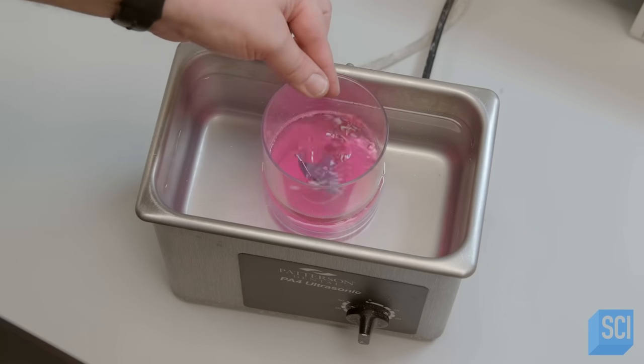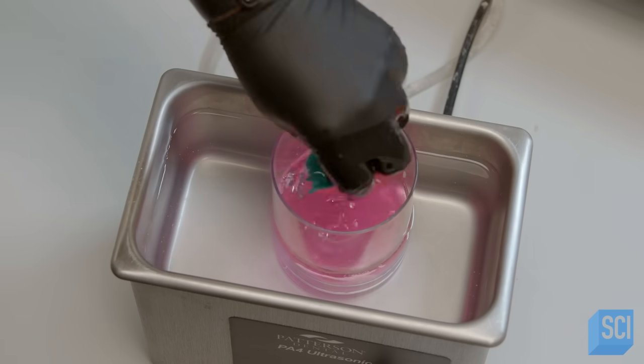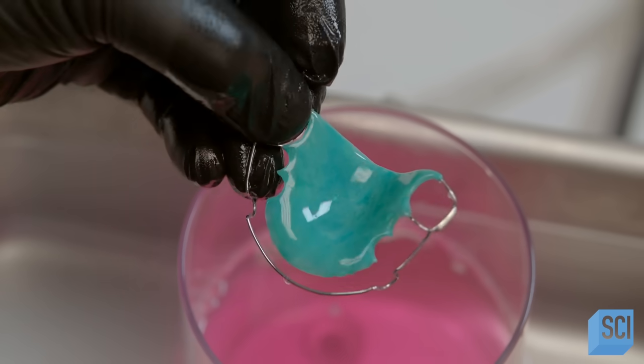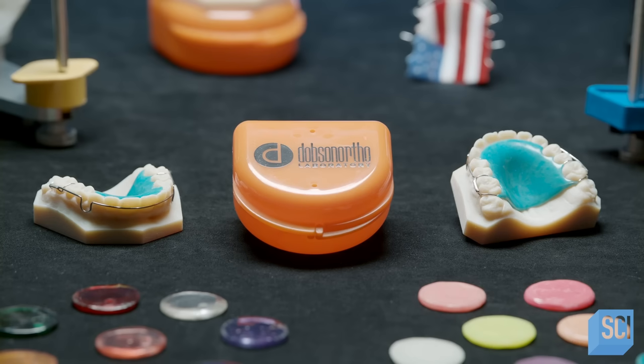Finally, he drops the retainer into an ultrasonic cleaning machine containing mild acid. The combination of acid and sonic waves removes the pumice and polish residues. Once the retainer has been rinsed with water and dried, it's placed in a storage case. Now it's ready to be shipped to the orthodontist.